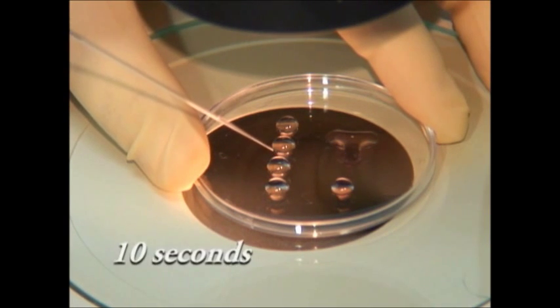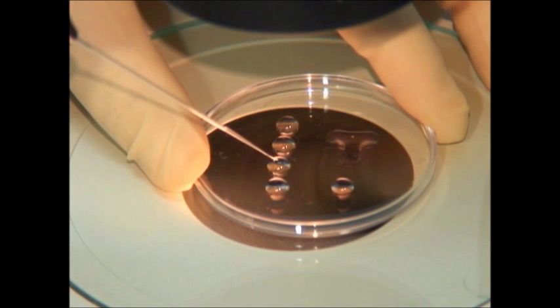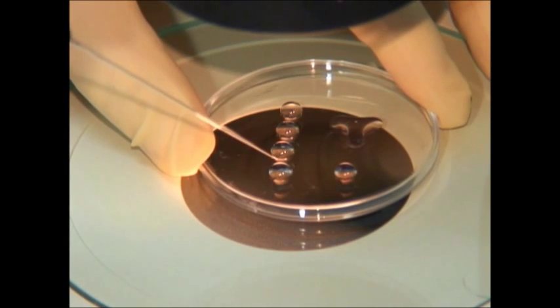The eggs should then be loaded onto the cryo tip, sealed on both ends and plunged into liquid nitrogen within 90 seconds.